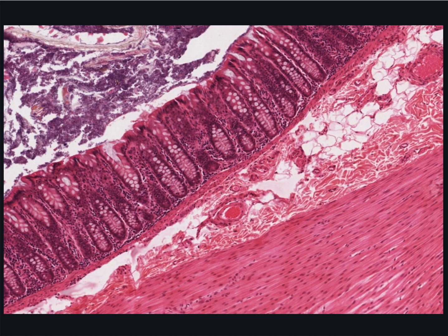So just from this brief description and viewing a few images, I want you to appreciate how different the mucosa is along the digestive tract. And so now, continue to view the lecture series looking at each of the organs in detail.